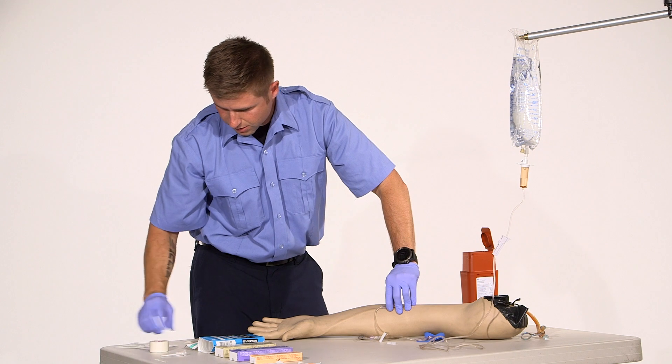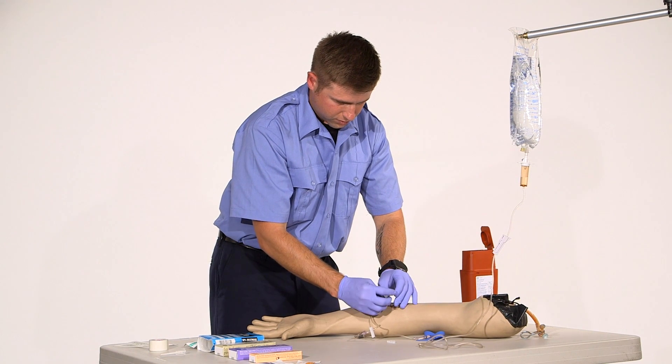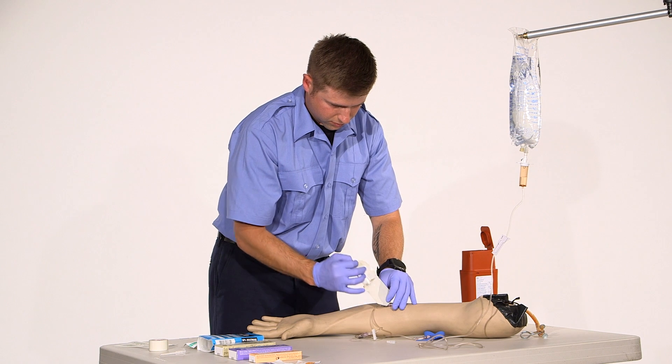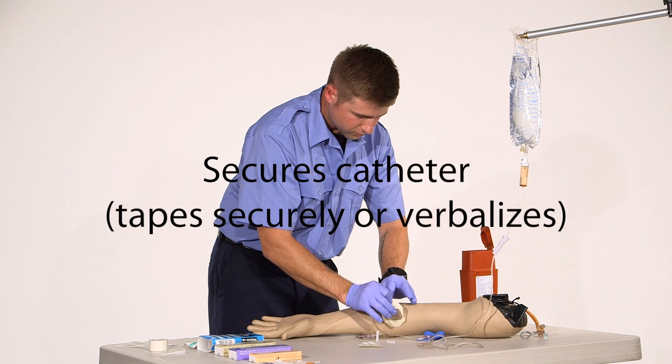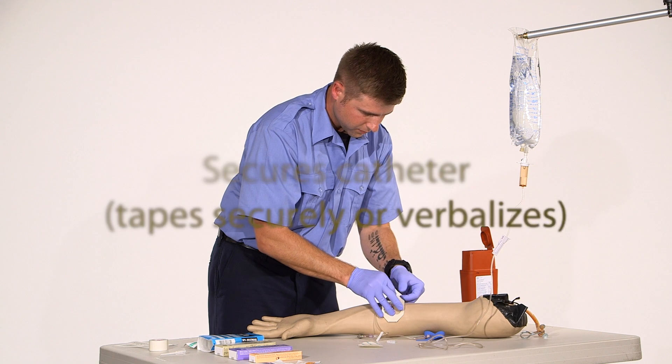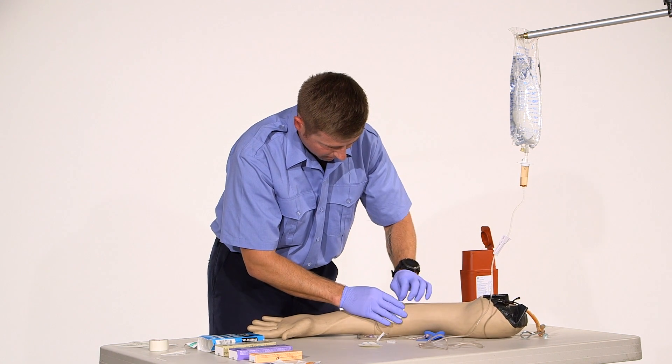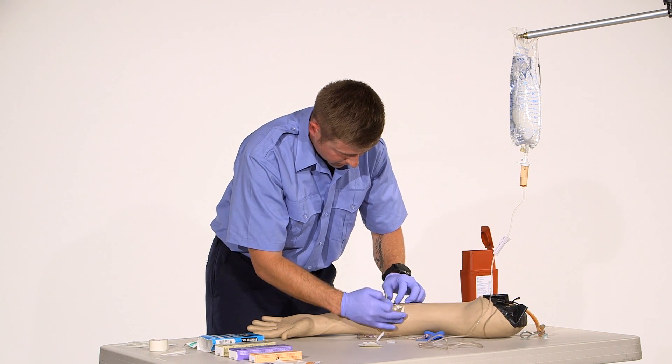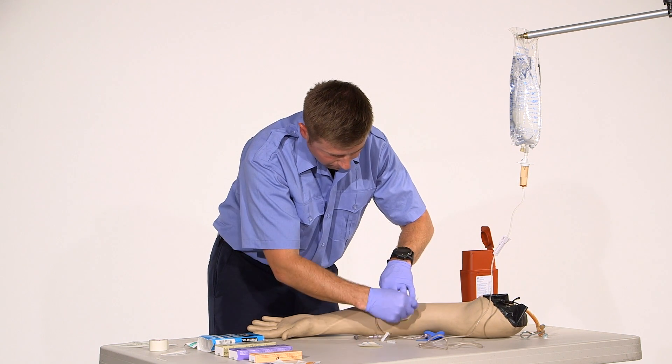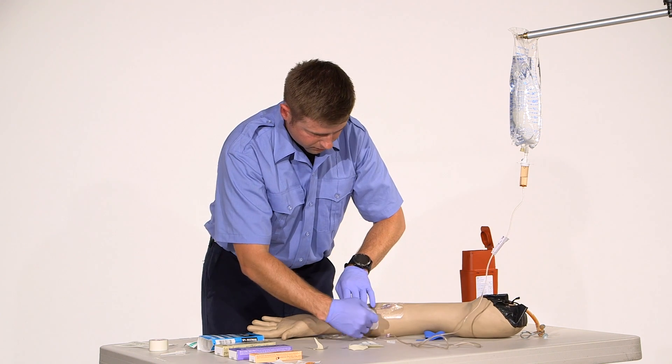Place this directly over the site. Tape secure the line.